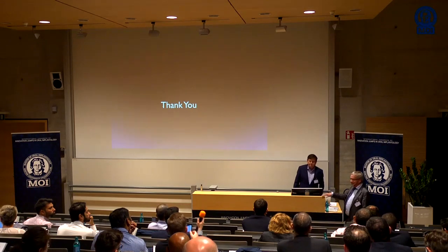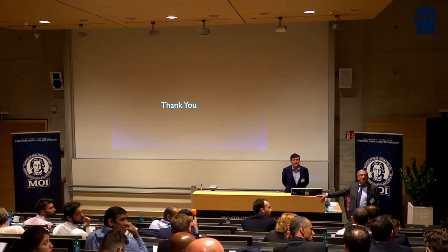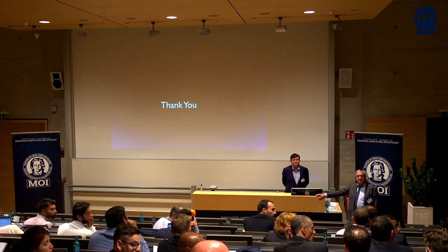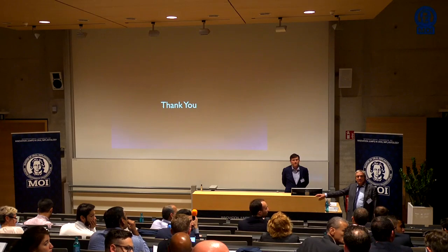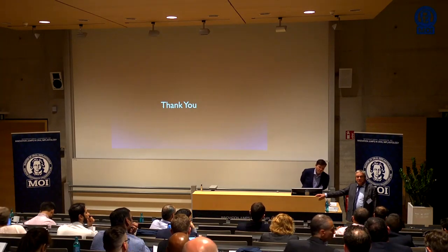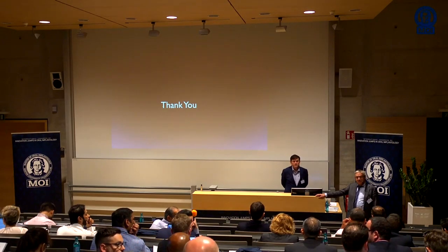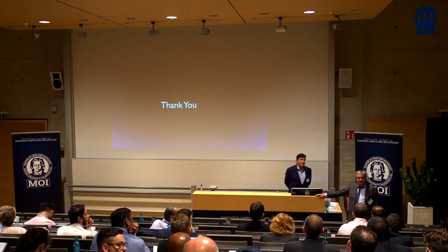Okay. So first question from Dean. Great talk, Mike. Thanks. Just two quick questions. One, how long are you leaving the temporary in place? Generally 3 to 4 months during the healing. And second question is, what's your final restoration? Is it zirconia or is it a hybrid?